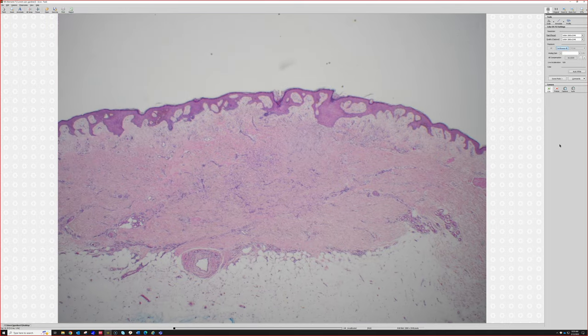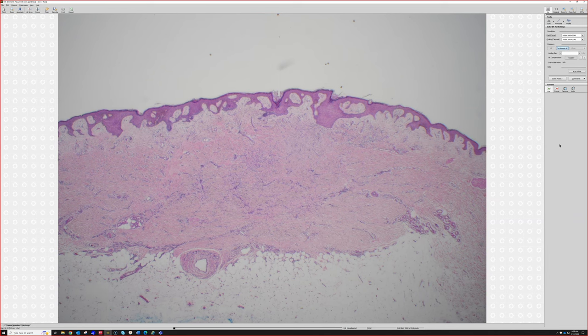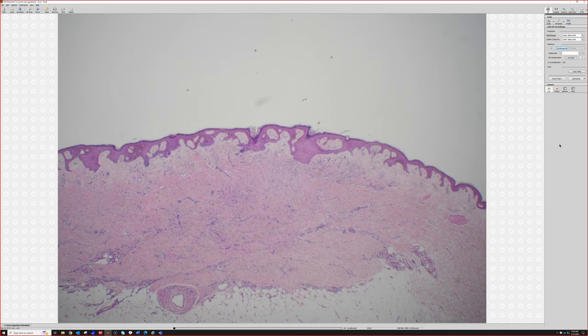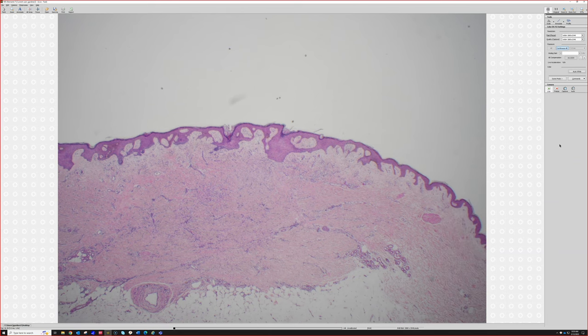From 2x, this is a dermatofibroma — very good. This has got nice induction over it like that last one, a little subtle hyperplasia, which sometimes DFs just have subtly.